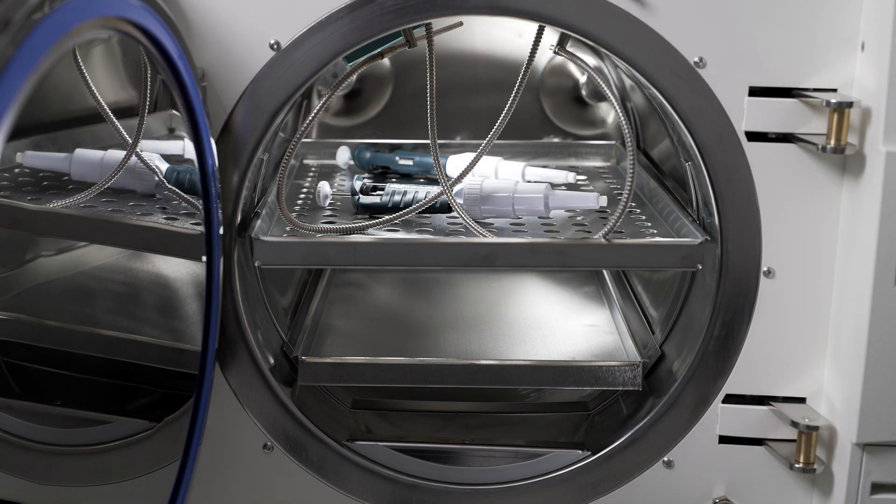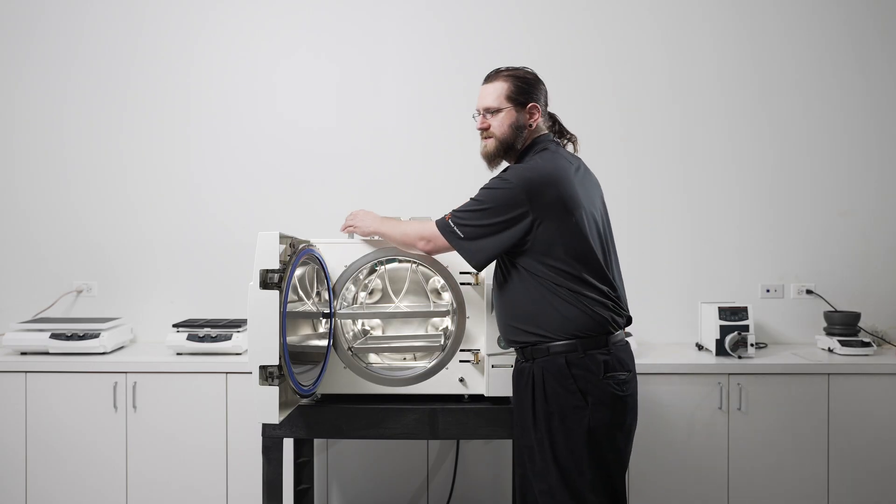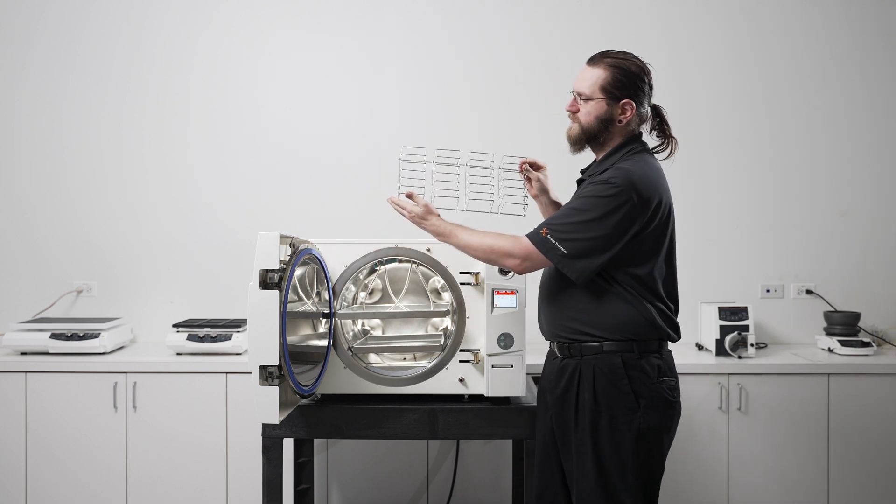When loading wrapped instruments, be sure to place them plastic side down so that they are not touching. We also have pouch racks available for the sterilization of large amounts of wrapped instruments at once.